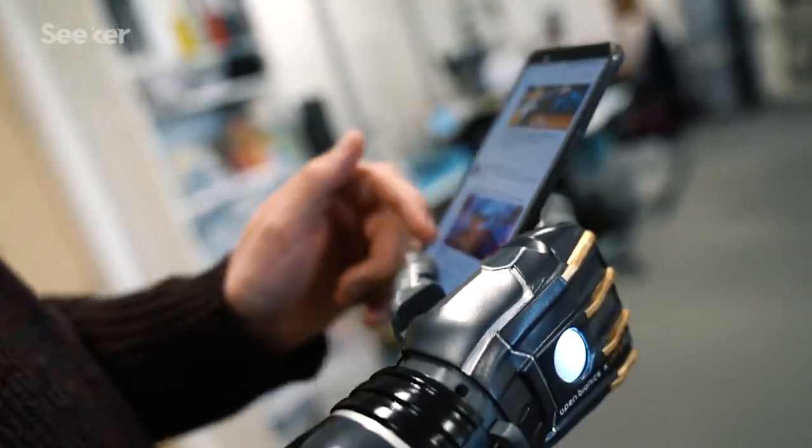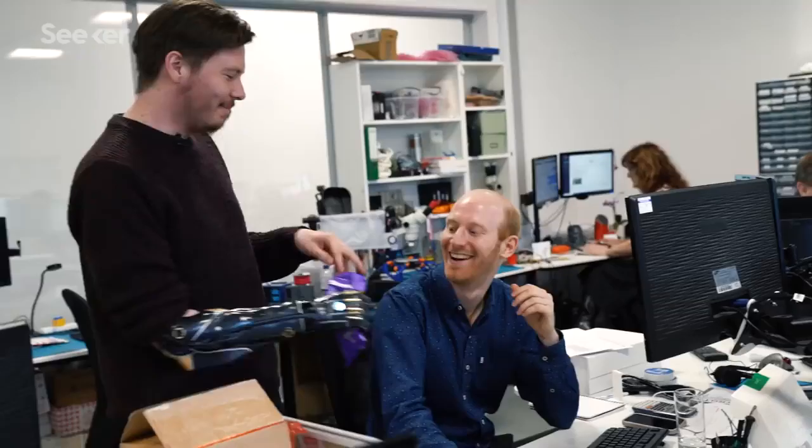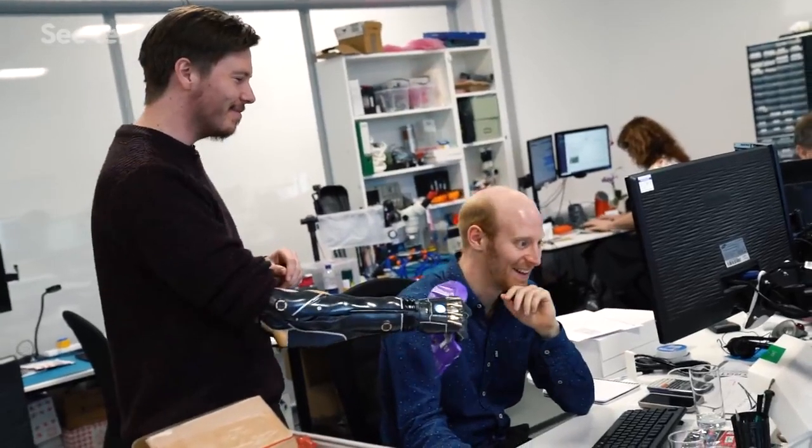I didn't think this kind of technology would be possible, especially at low cost. It's just crazy — especially what I can do with the arm compared to what I was able to do three years ago, but even back then that was still mad.